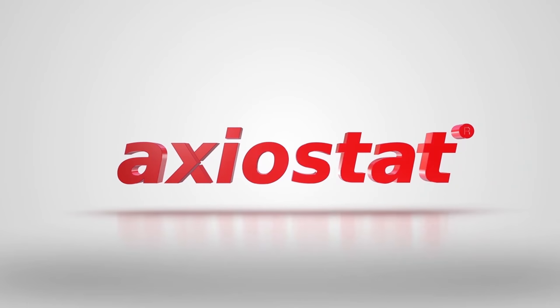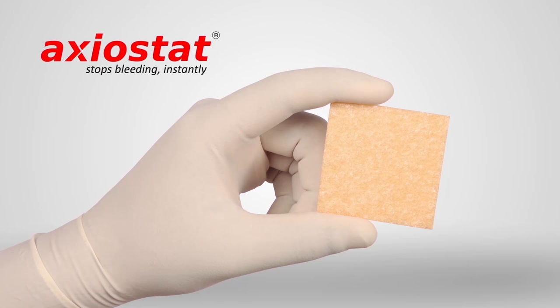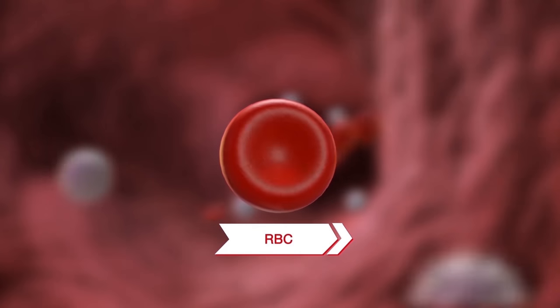Introducing Axiostat, a revolutionary medical dressing specifically designed to stop uncontrolled bleeding. Now, let's take a look at exactly how Axiostat works.